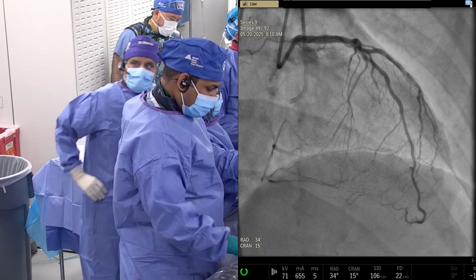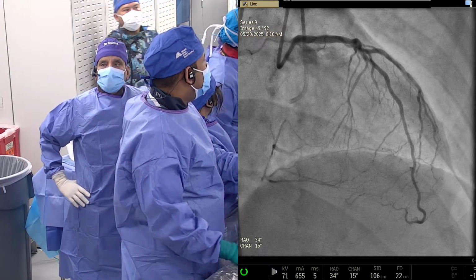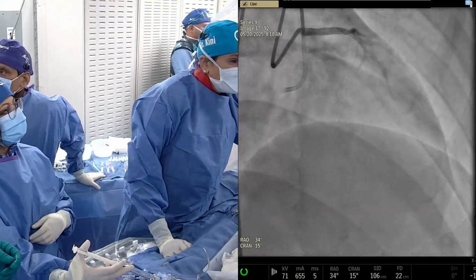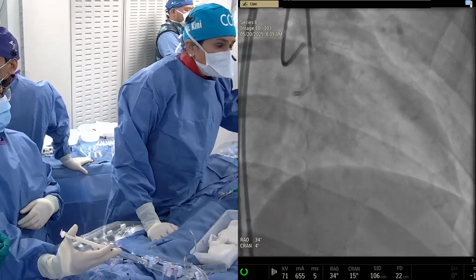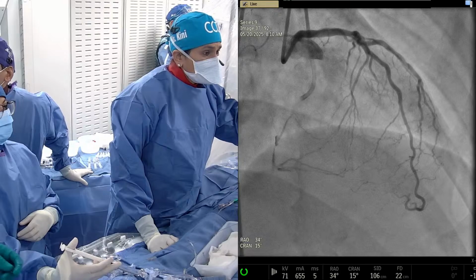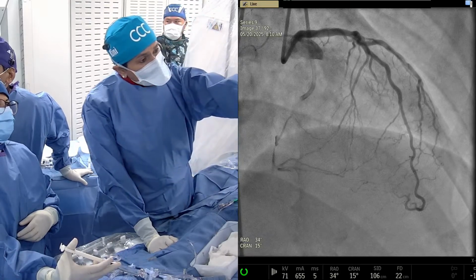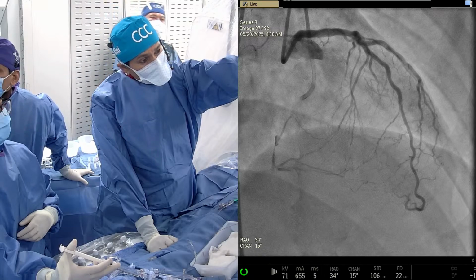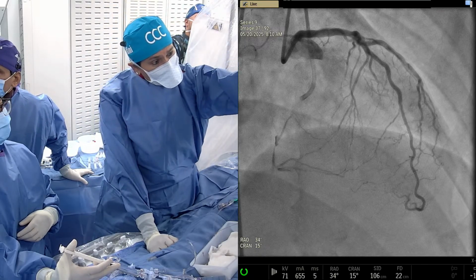Anu, tell us. So now, if you see here, there are multiple septals. Ideally, you need a straight connection. If I go back here, let's see. The first is not connected, the first branch. The second looks like it is connected. So let's try that.